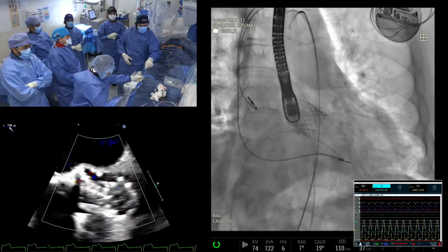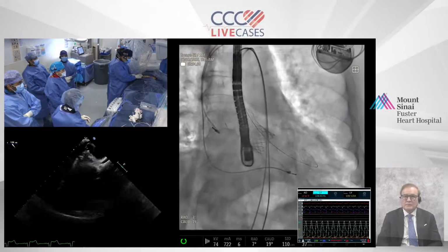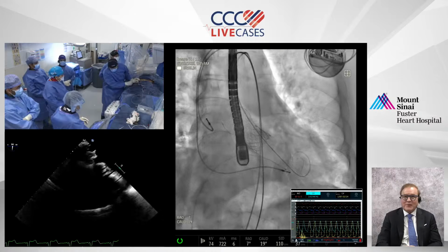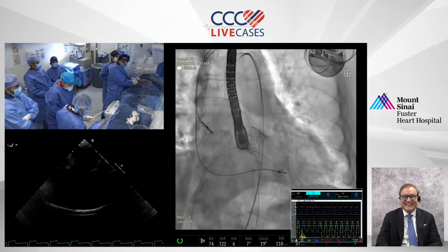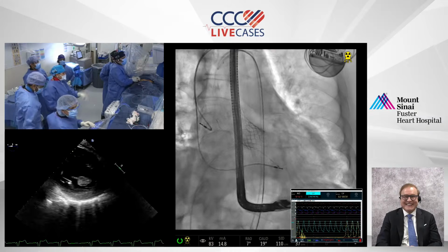Pedro Moreno. Yes, I'm listening. This is like doing provisional stenting and then looking at the side branch. Correct. Do you want to do something or walk away? So that's what we are looking at right now.